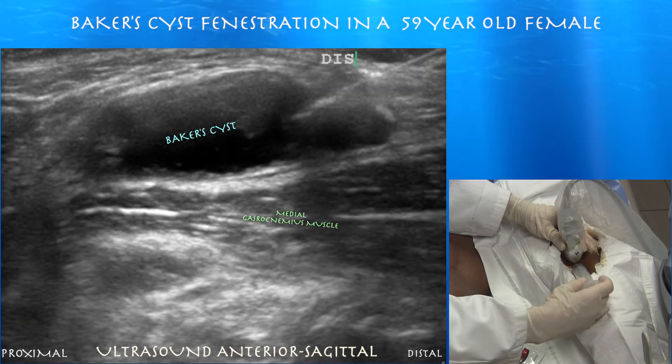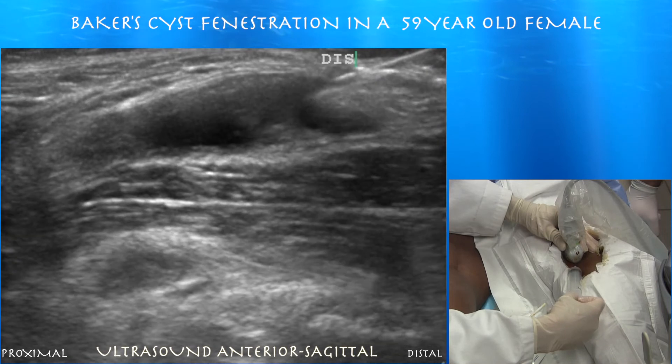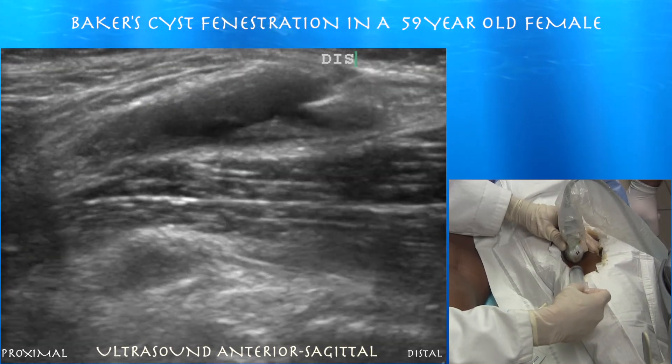Here you can see the needle going into the inferior aspect of the Baker cyst. Sometimes you're actually just pushing the capsule proximally and not actually inside the cyst, so you have to make sure you pop inside it in order to drain it.